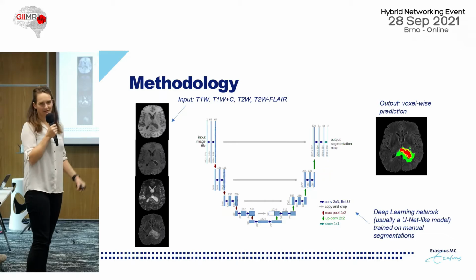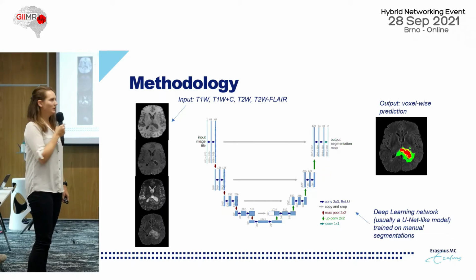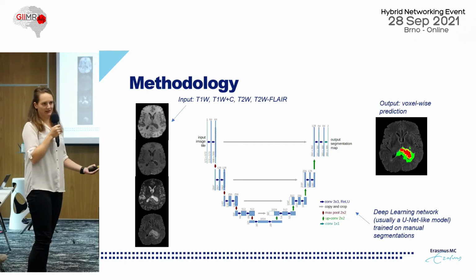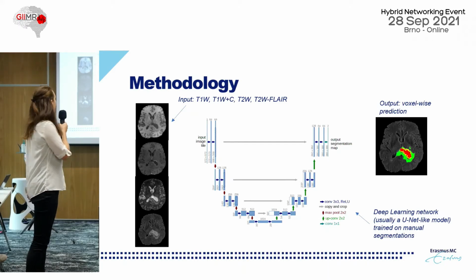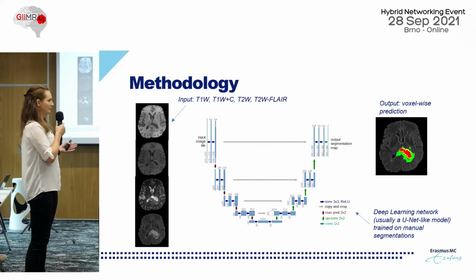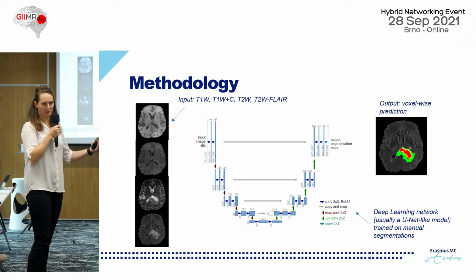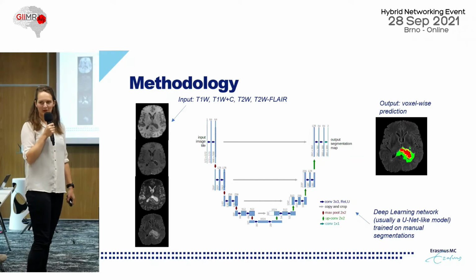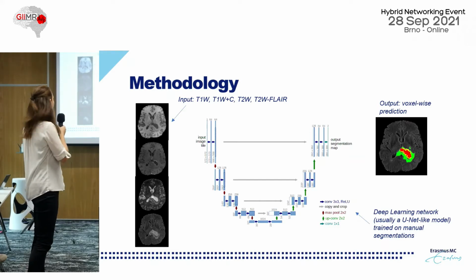For the BRATS challenge, it has 3 different parts. So there's edema, contrast enhancement, and the tumor core or the cystic or necrotic component. And this deep learning network is trained on data. So whatever you put in, you're going to get out. So that's why from now on, I'm going to completely disregard the deep learning method underlying, just look at the data.